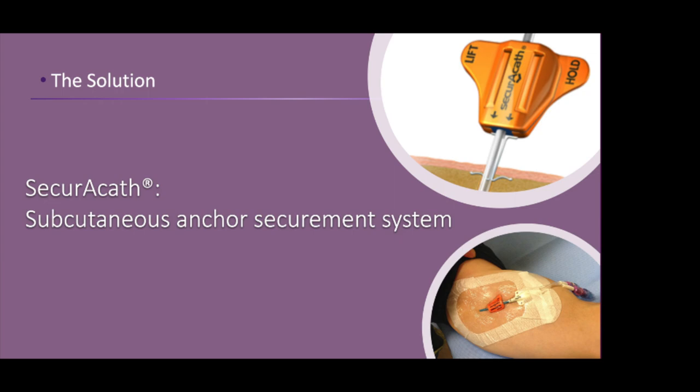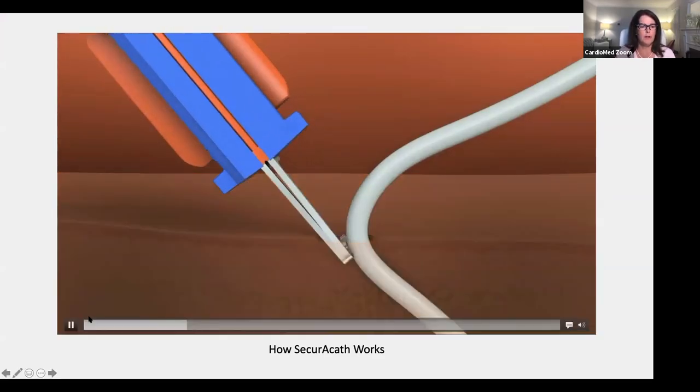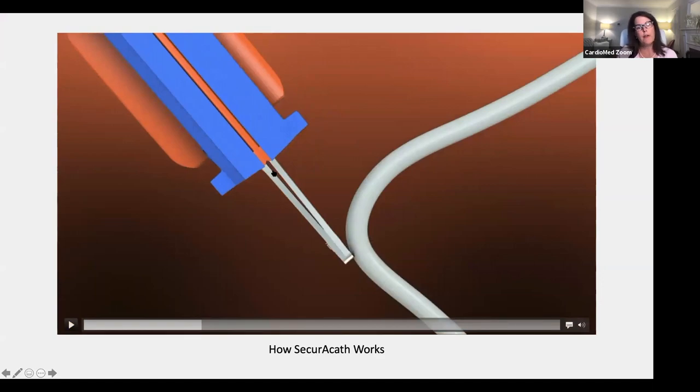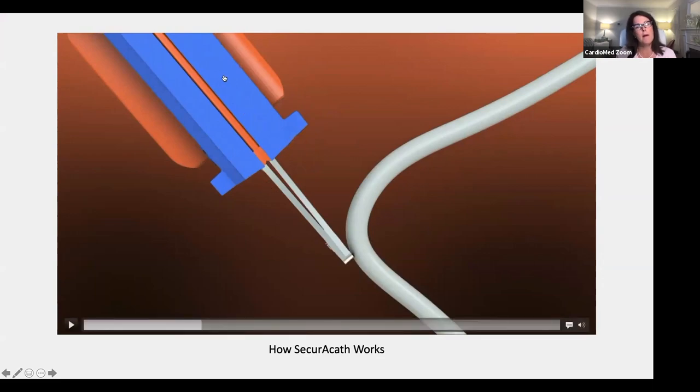Now let's have a quick look at how the line would be inserted so that you have a better understanding of how it works when you do get a patient with a SecurAcath in place. So here you can see the SecurAcath, and I'm just gonna pause the video for a moment. What you see here on the screen, there's two nitinol legs, which are laser cut, that are inserted into the subcutaneous space through the insertion site of the PICC. So it's inserted just through the skin, and then there's a base that the legs are attached to, and you'll see further the other components of the device in just a moment.